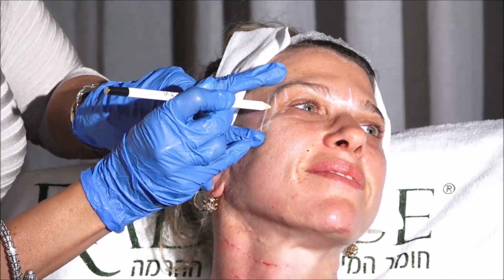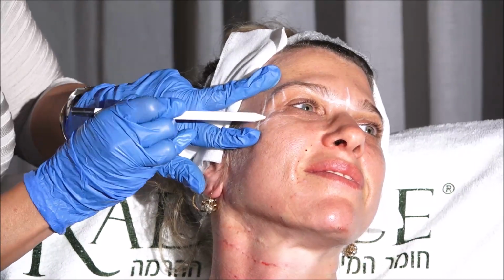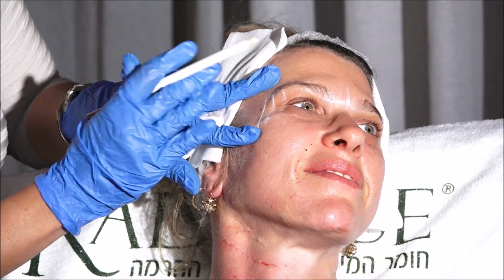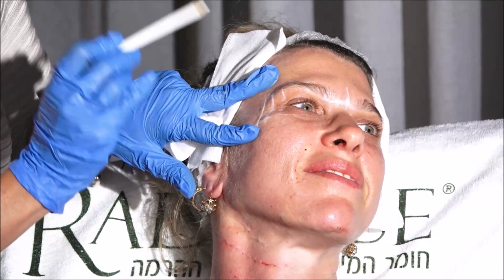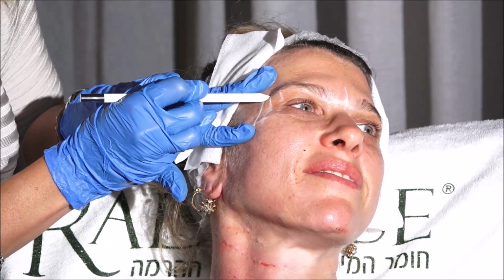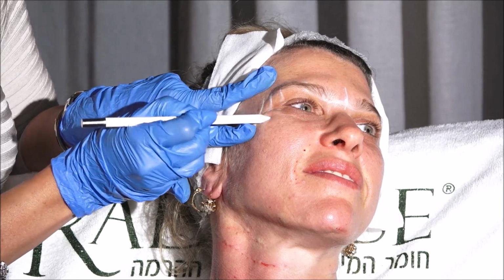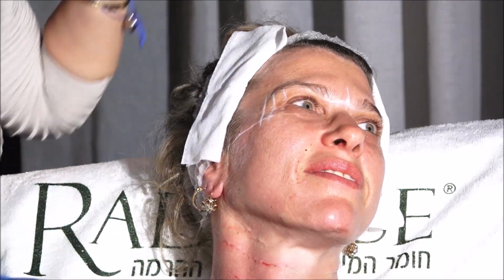So she's fine, these 3 points, but I can play with the dose. If I would use 15 units for her, 5 in each point, I can do less here and more in the lower ones. So I can do 3 units here instead of 5. I can do 6, 6. I do more dose where she contracts more, depending on the pattern.